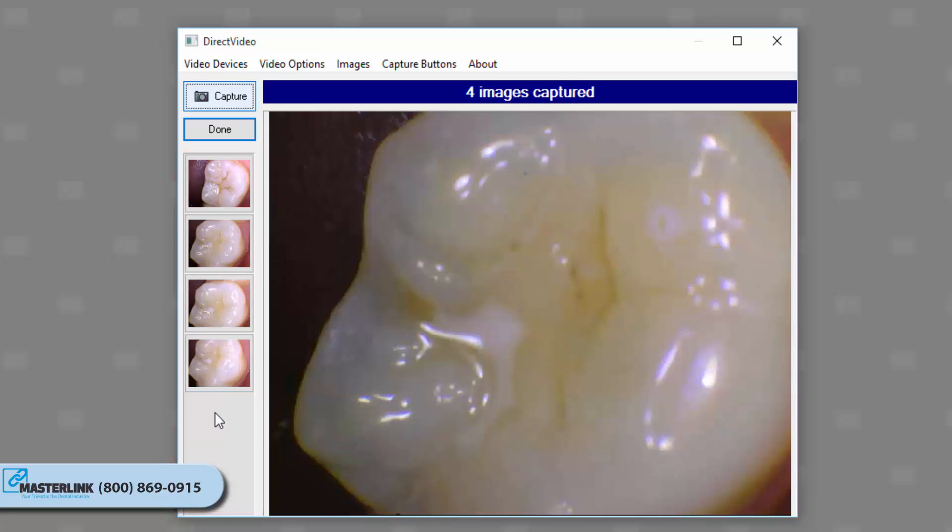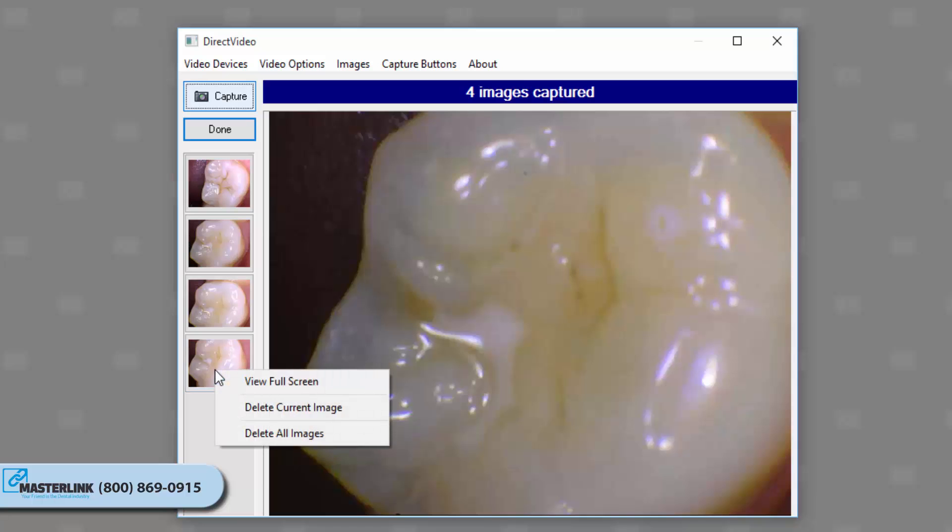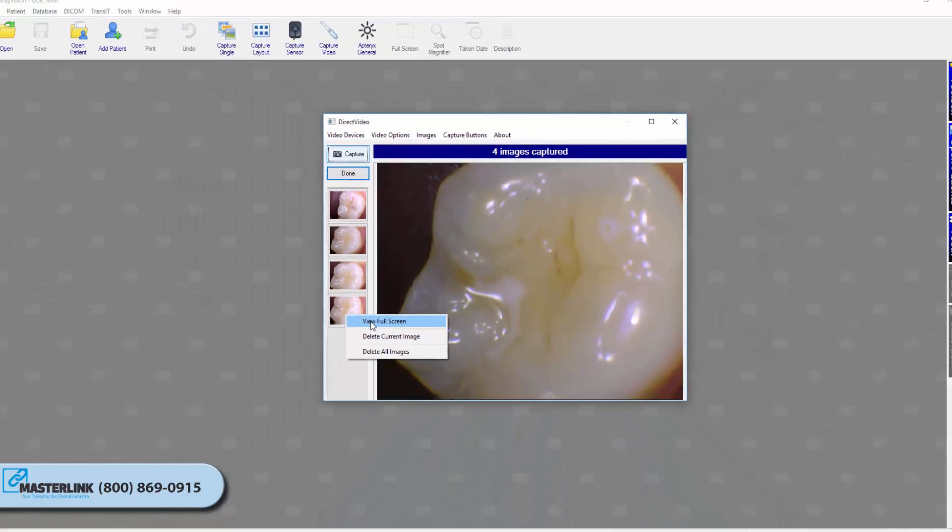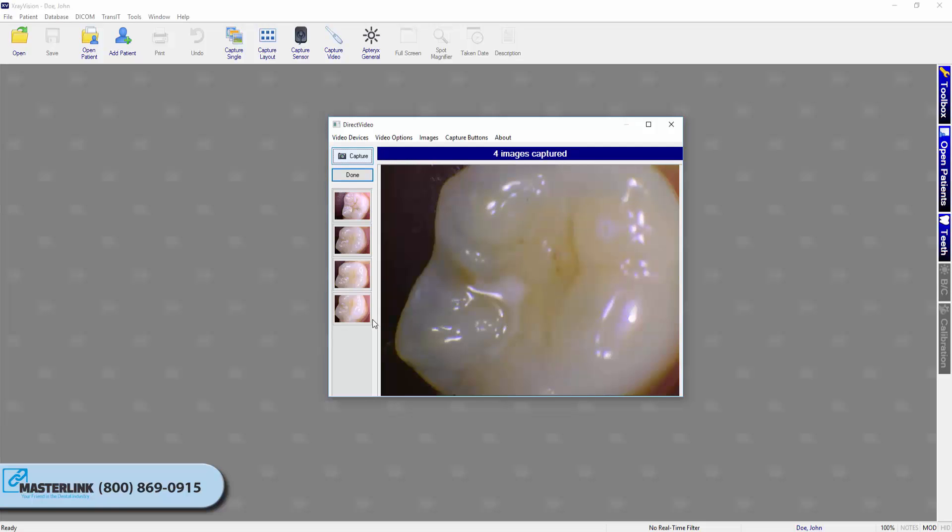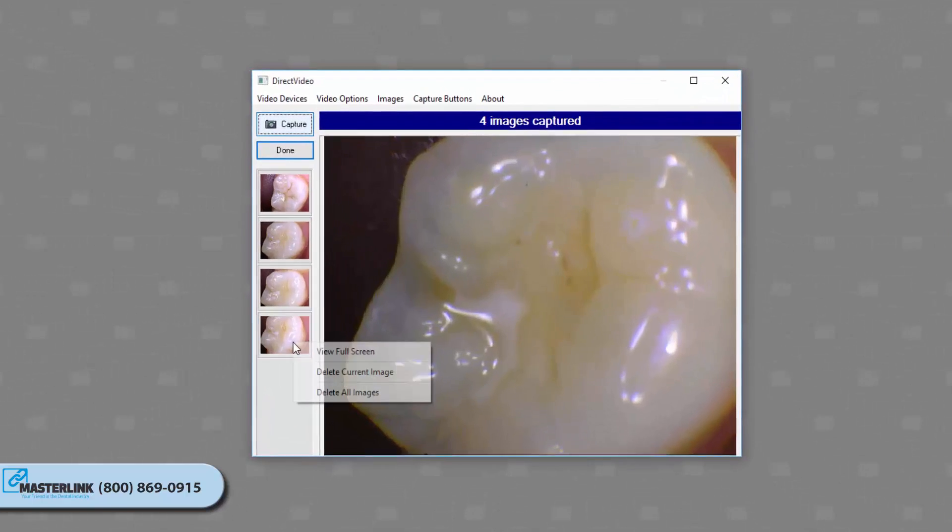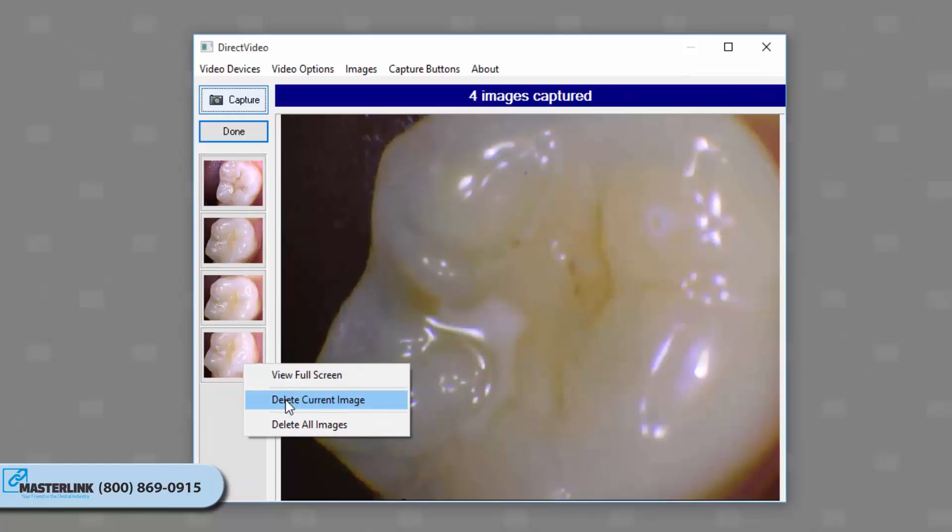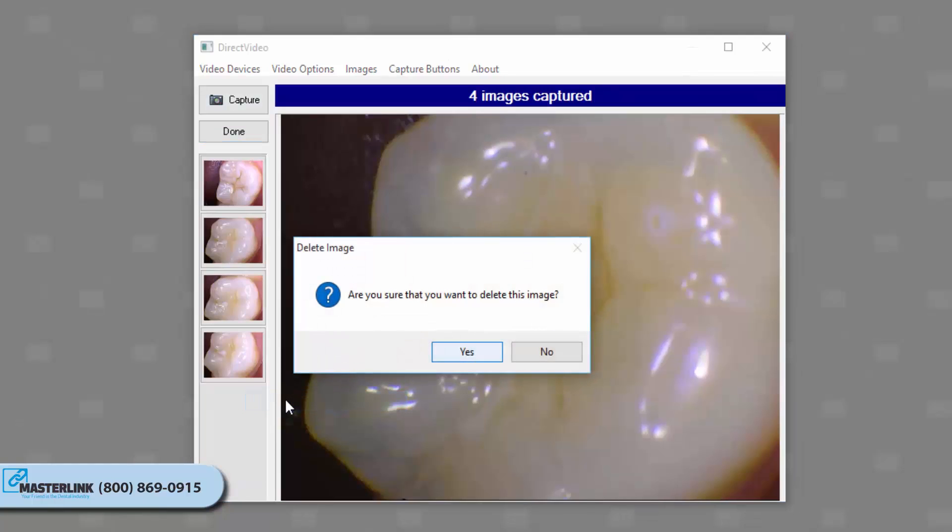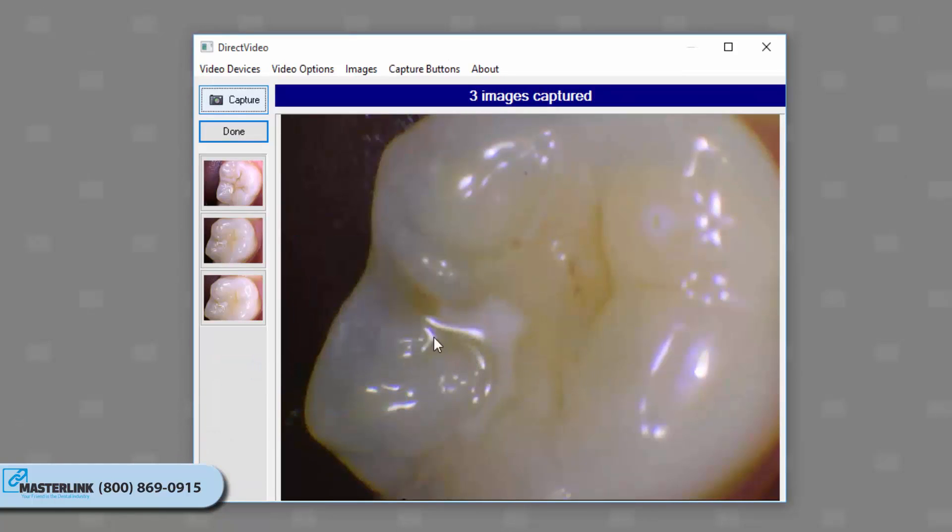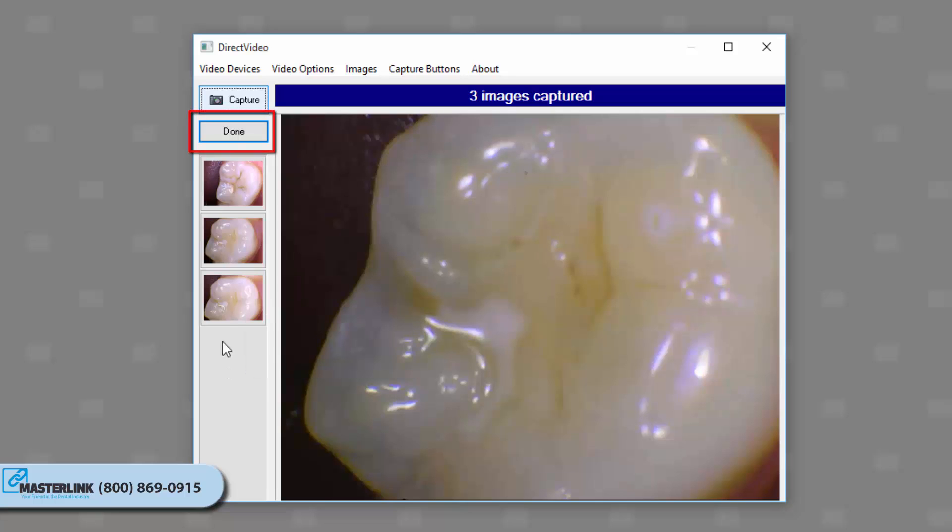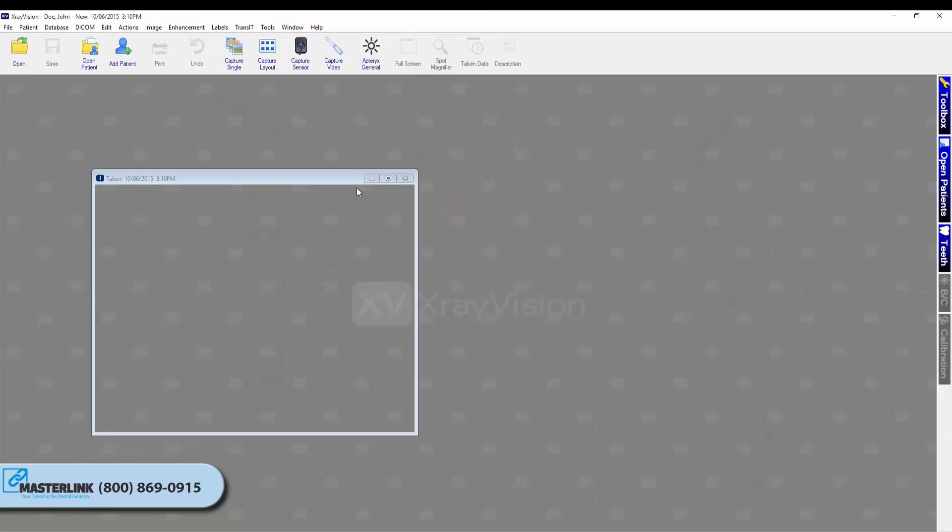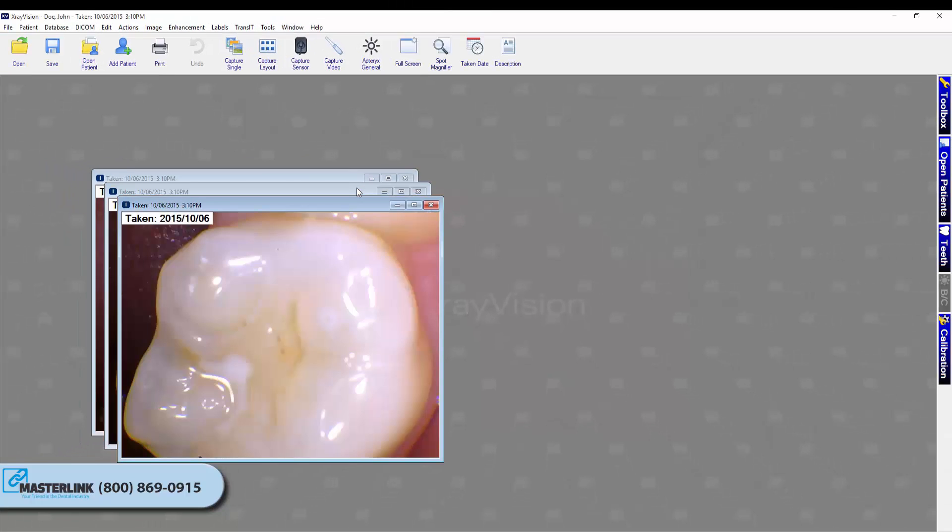Users can right-click on one of the image thumbnails to perform the following operations: View Full Screen, which opens the selected images in a full screen view; Delete Current Image, which deletes the selected image from the list of thumbnails; or Delete All Images, which deletes all of the image thumbnails in the list. When finished, click the Done button. The direct video interface will close and the image or images will be acquired and displayed on the application desktop.